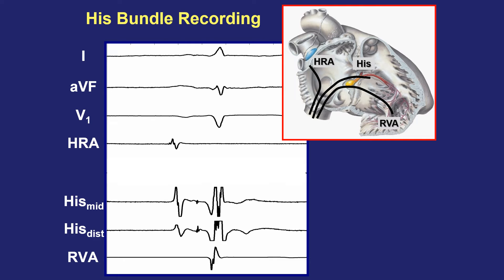Let's analyze a simple multi-channel recording. At the top are three surface ECG leads; below is a high right atrial catheter with a signal timing near the sinus node; then a quadrupolar His catheter showing mid and distal pairs with atrial, His, and ventricular signals; and at the bottom a right ventricular apex catheter with a ventricular electrogram timing with the surface QRS.